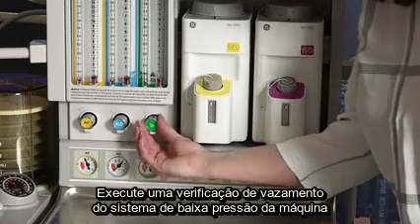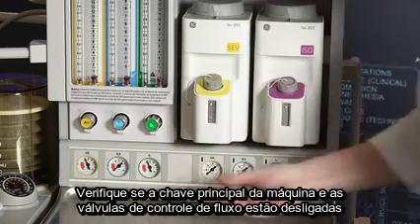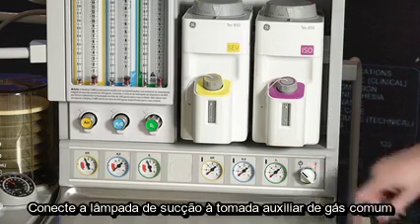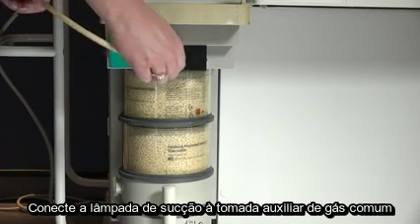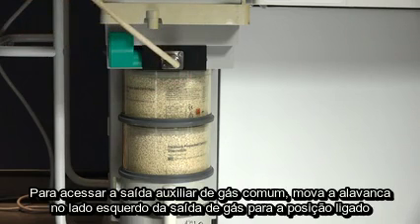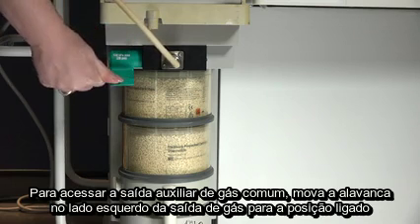Perform a leak check of the machine's low pressure system. Verify that the machine master switch and flow control valves are off. Attach the suction bulb to the auxiliary common gas outlet. To access the auxiliary common gas outlet, move the lever on the left side of the gas outlet into the on position.